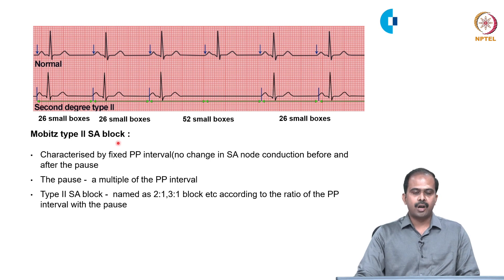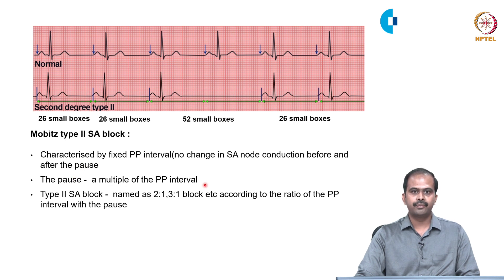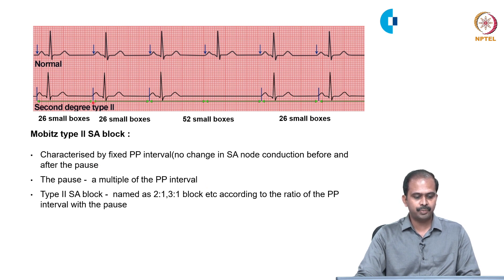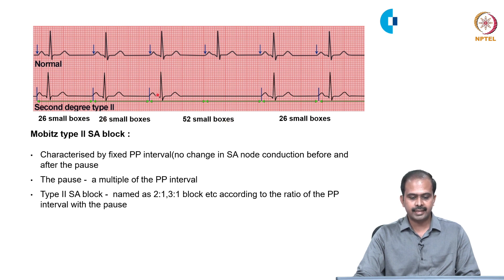Mobitz type 2 block is characterized by a fixed PP interval with no change in SA node conduction before and after the pause. The pause is an exact multiple of the preceding PP interval. In this example, the PP intervals are equal before the pause, and the pause is an exact multiple of the preceding PP interval, confirming Mobitz type 2 SA block.